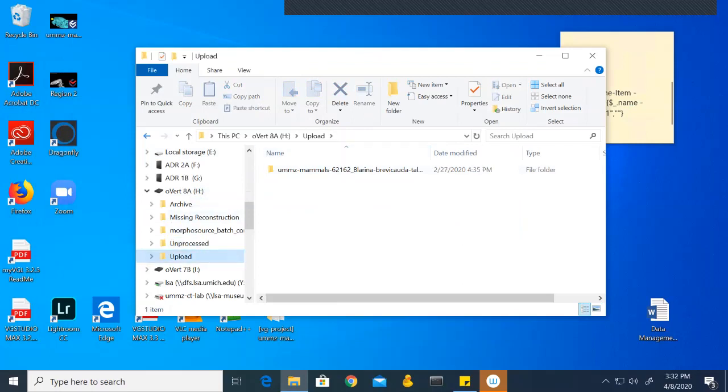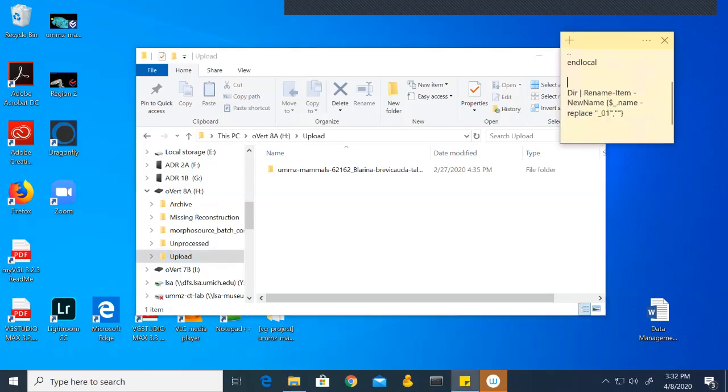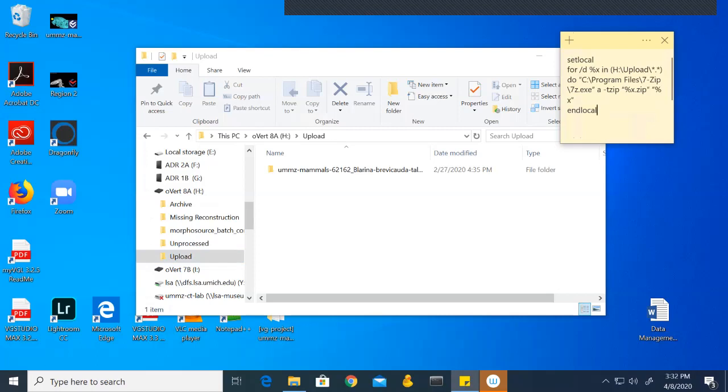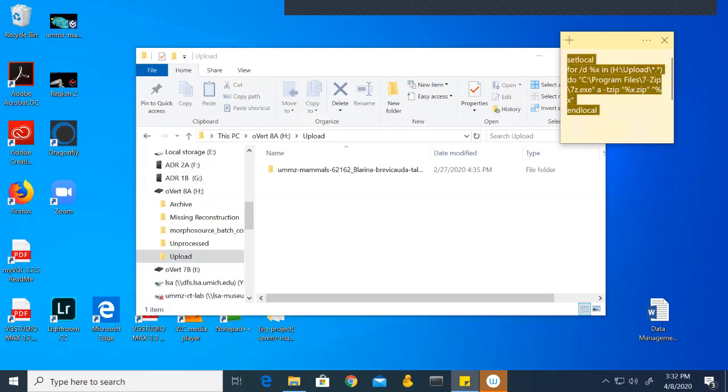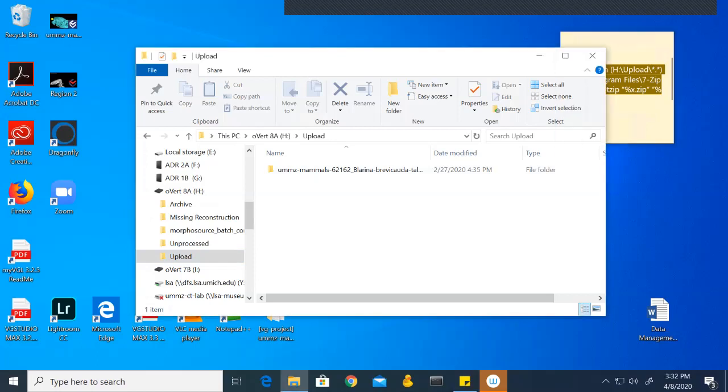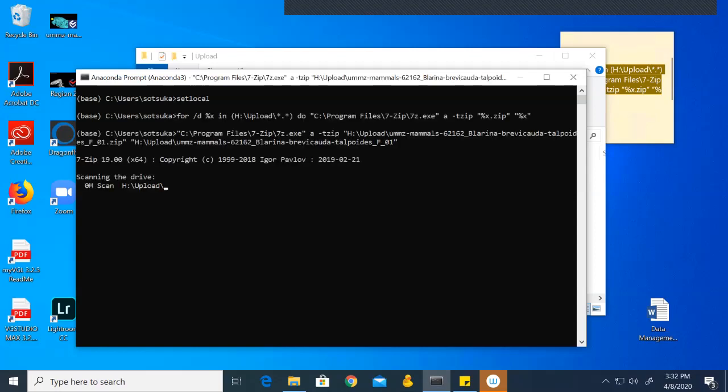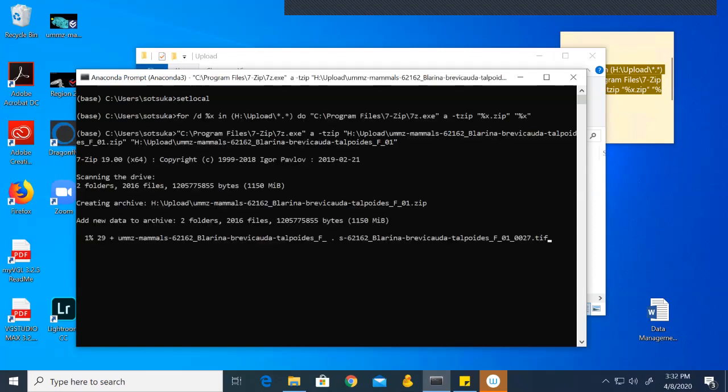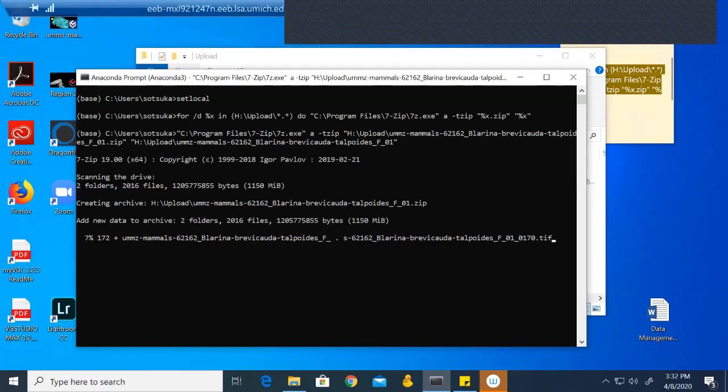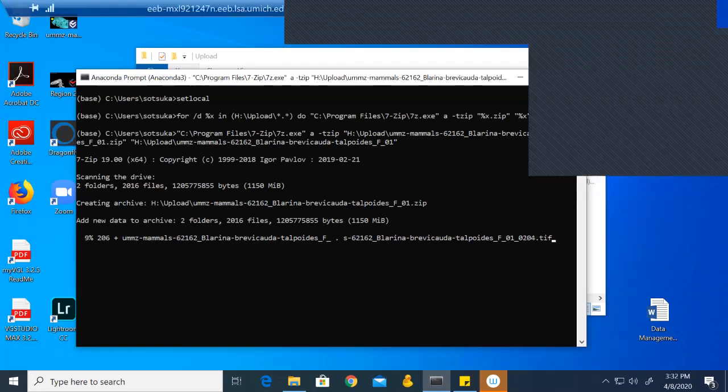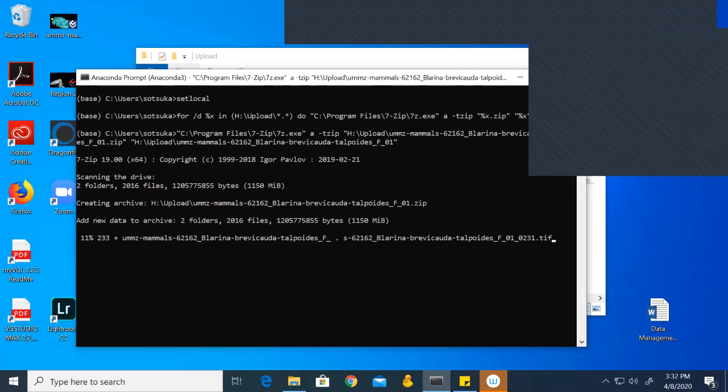To compress this, we have a code which we can copy. On this sticky note here, I'm just going to copy this first code. Next, I'm going to open the anaconda prompt here and paste it. Again, this process can take a little bit depending on how many specimens you have, and so we are just going to skip over the waiting period.